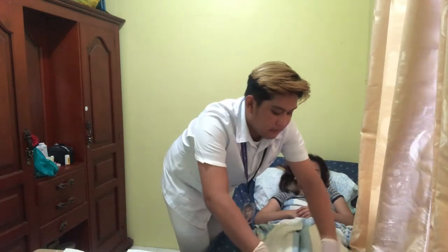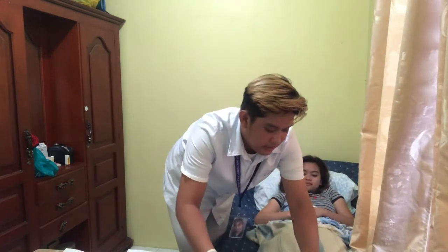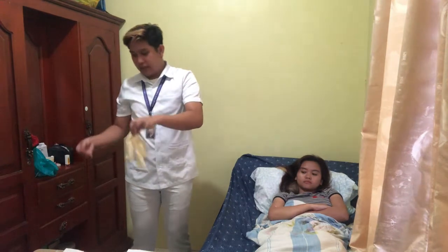After that, cover the area that was exposed. And next, we're going to remove the gloves and perform hand hygiene. Okay, discard it as well.